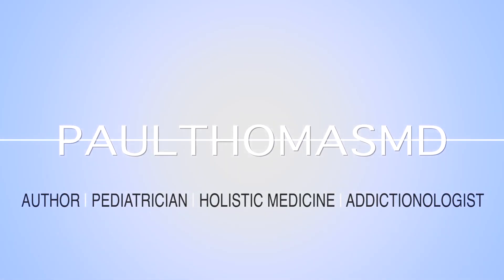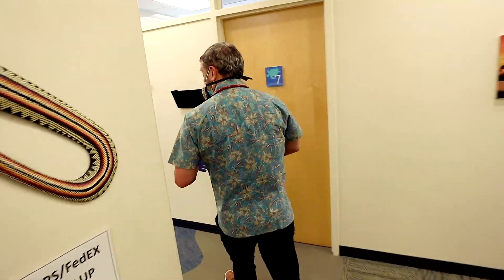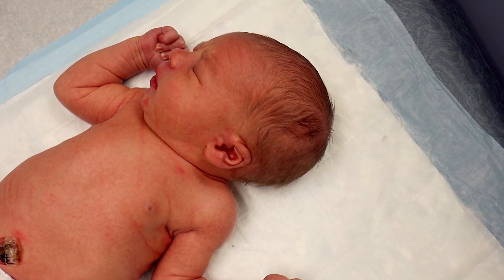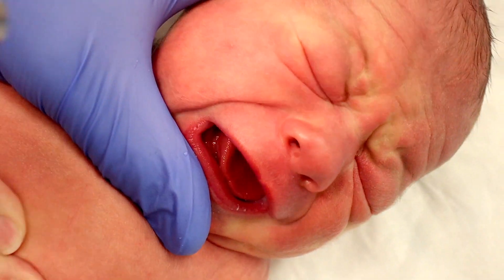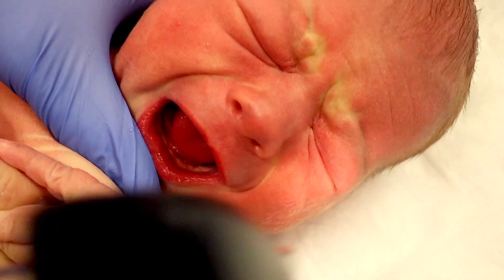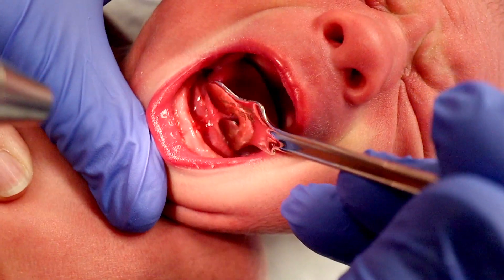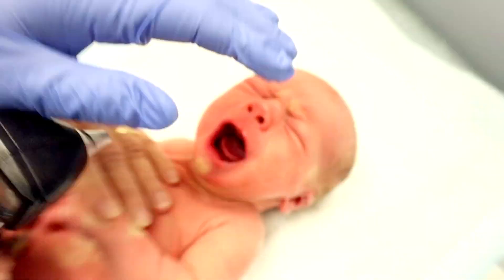I'm going to let her hold the light for me if that's okay. You'll see there's a membrane under the tongue. There's a drop of blood in there, but it's loosened up a couple millimeters.